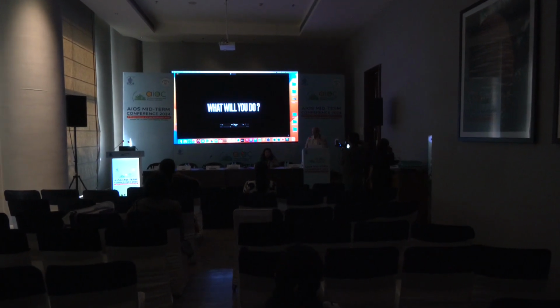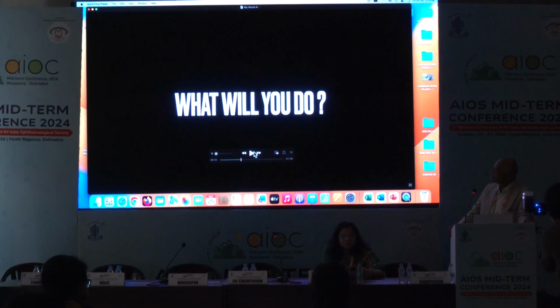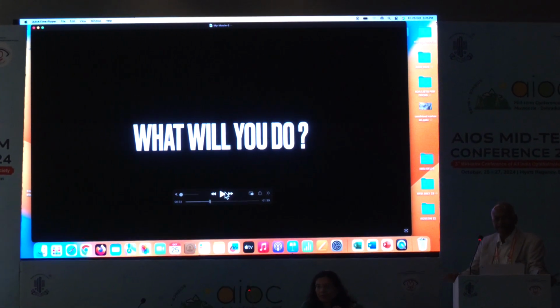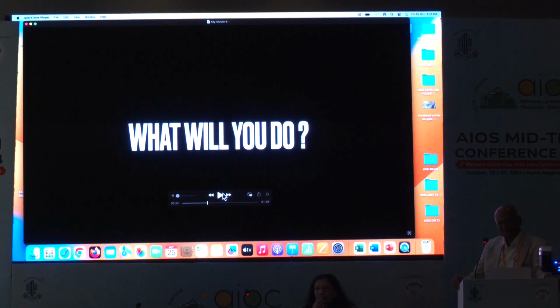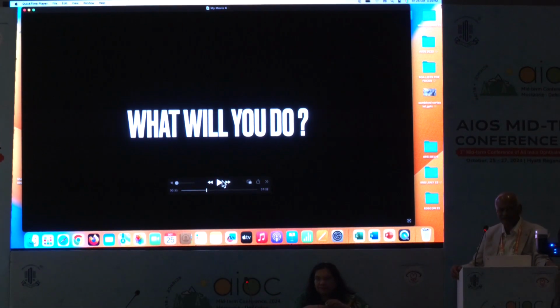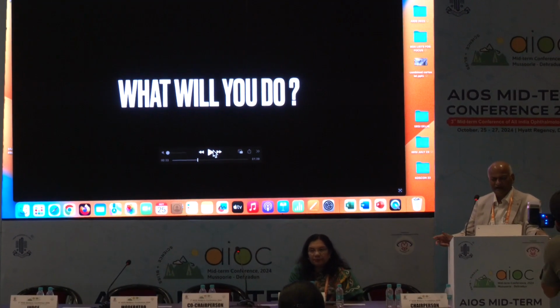Now once I have cut the capsule, there is a lens, and in that I want to do the phacoemulsification. So what do you feel is to be done now? Because he will convert it to SICS as the posterior capsule is very weak, or he will do something. What will he do in this situation? So what do you feel?